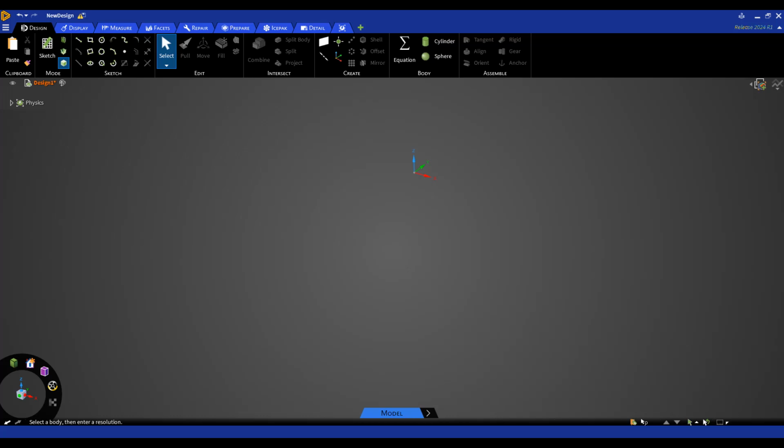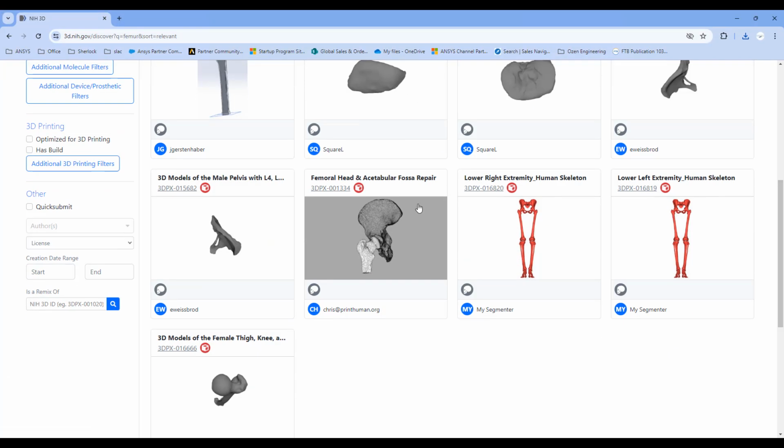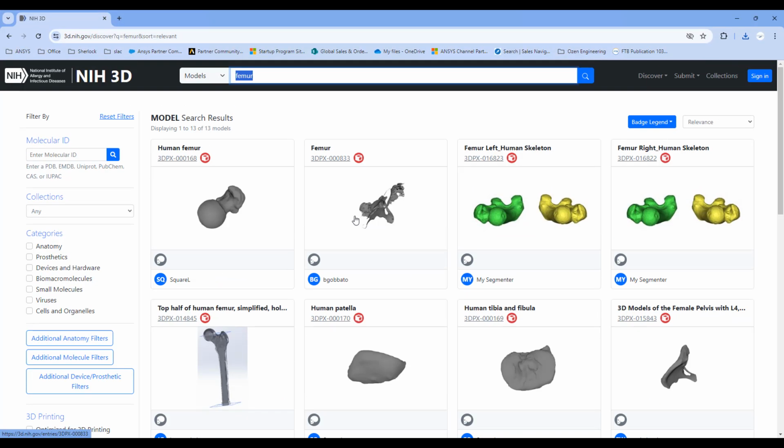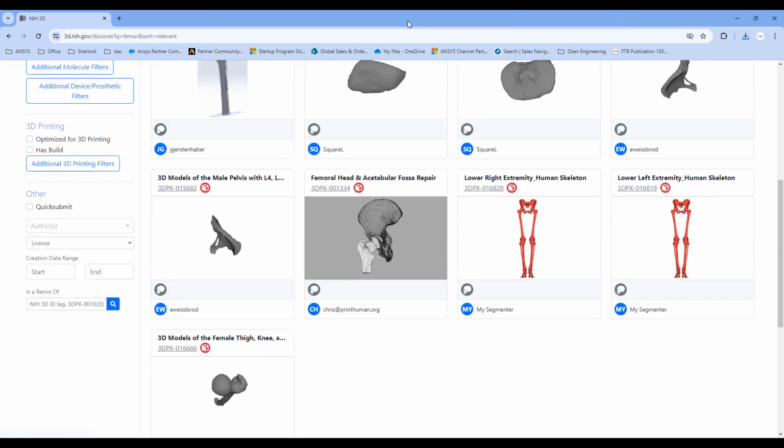In this video, I wanted to show how to convert STL files into 3D CAD. So I found this really cool website, NIH, that gives you a variety of STLs that are publicly available for body geometries to download. So if you're developing products for prosthetics or implantable devices, we got femurs, we have all kinds of organs and other things you can download.